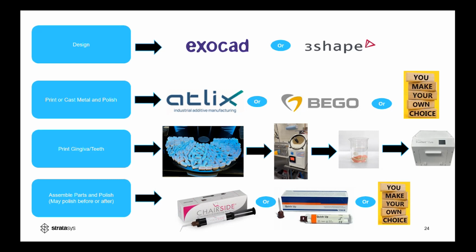So we're very fortunate to have the technology on our side for these types of apparatuses that we can give to our patients. And we know that everything is going to be completely digital and it's all going to work perfectly.